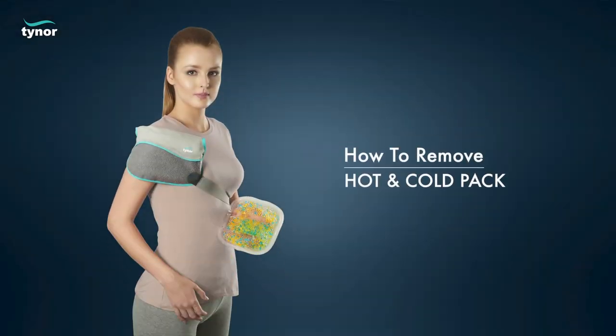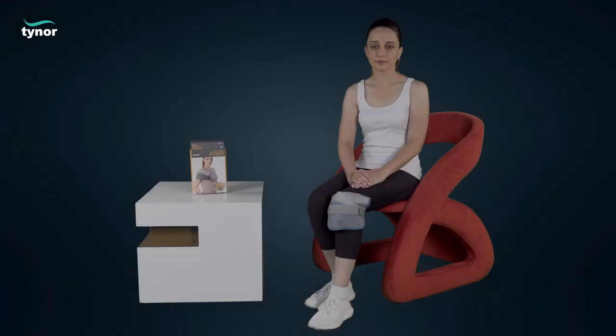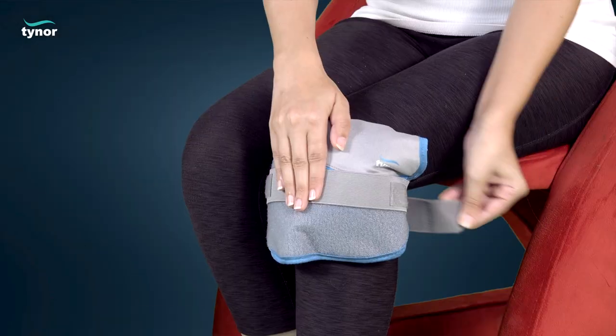Now let us see how to remove the hot and cold pack. Unfasten the hook loop for easy removal.